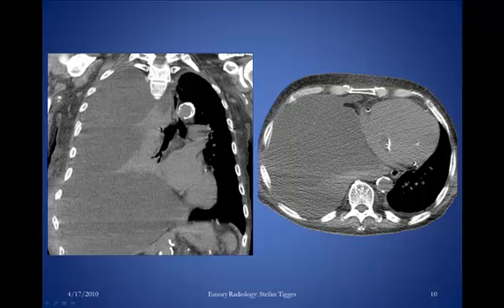These additional images show the same case. Notice how much bigger the right hemithorax is than the left — this patient has completely filled the right hemithorax with fluid, and the mediastinum has shifted over into the left hemithorax. If you see such a huge pleural effusion like this, probably the first thing you should think about is that this is a malignant pleural effusion.